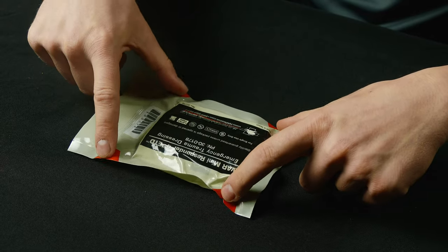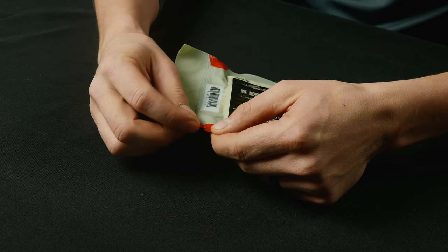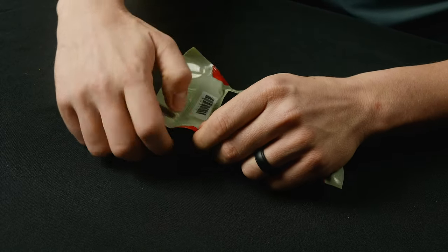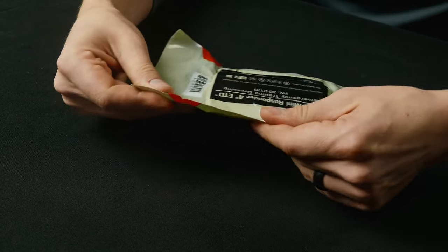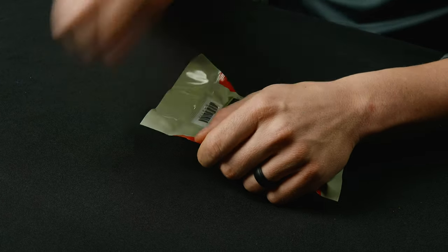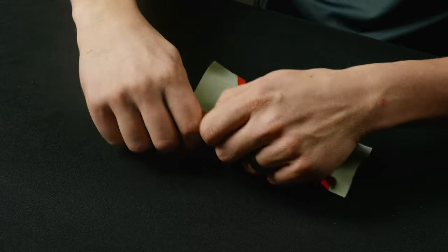You have these red places on the corners — these are where it has a start for tearing them open. So if you have to quickly get into this, or if your hands are bloody and it's hard to get in, these are your tear points. You just grab this, tear it, and you can open these up pretty easily.